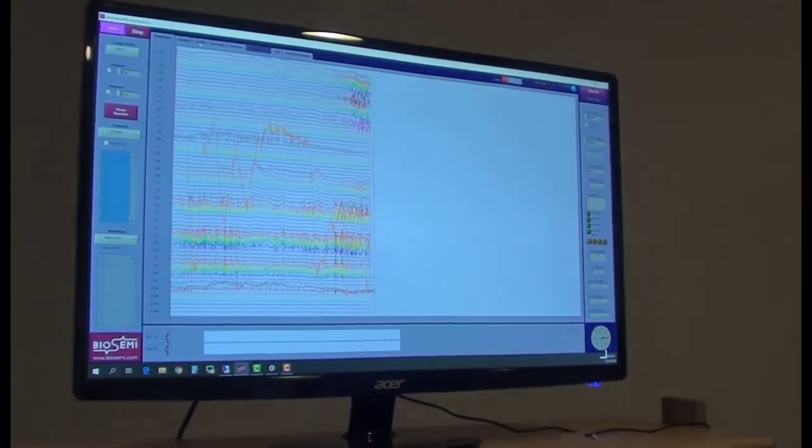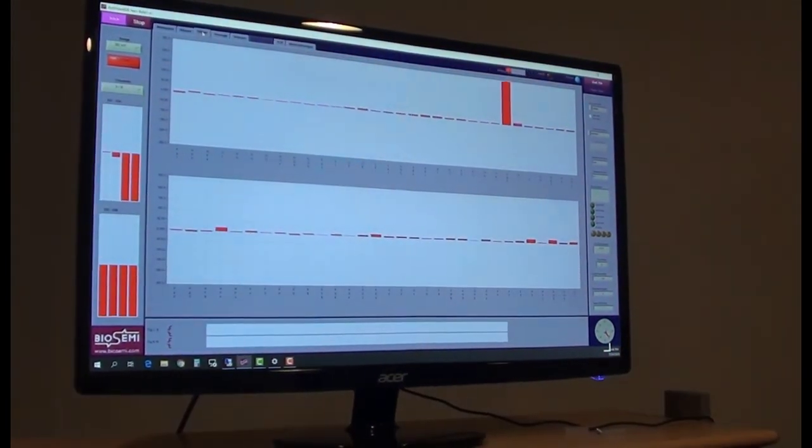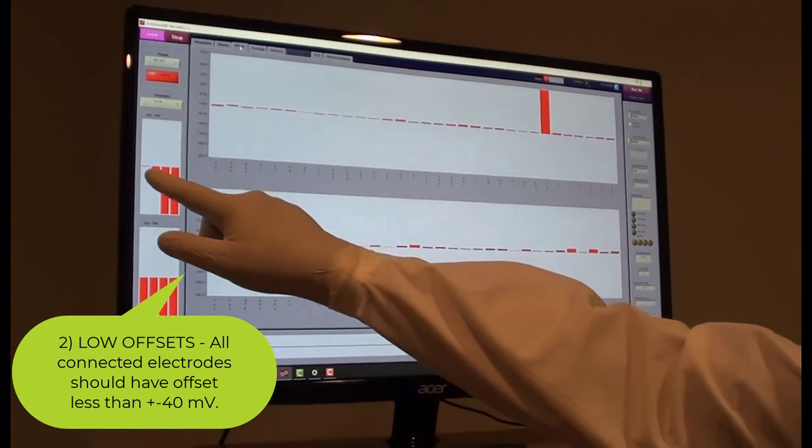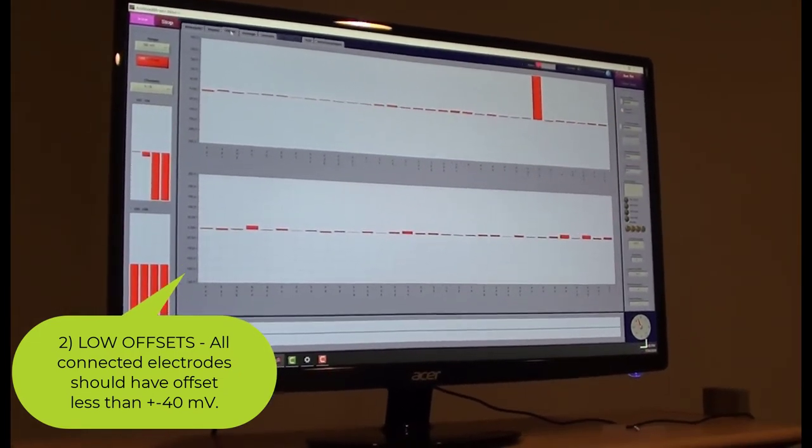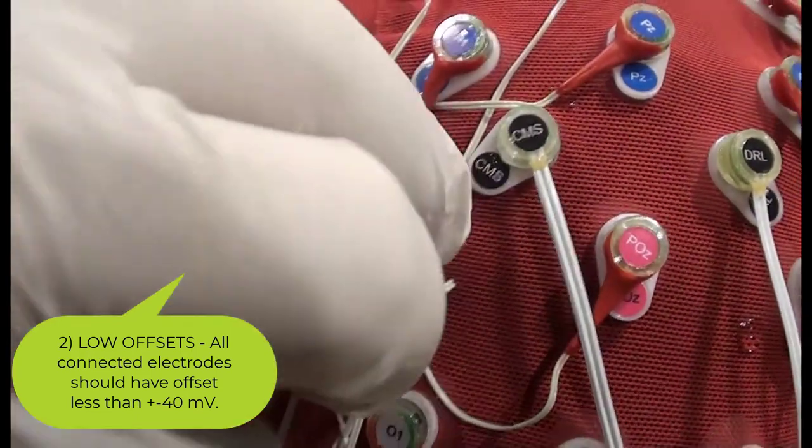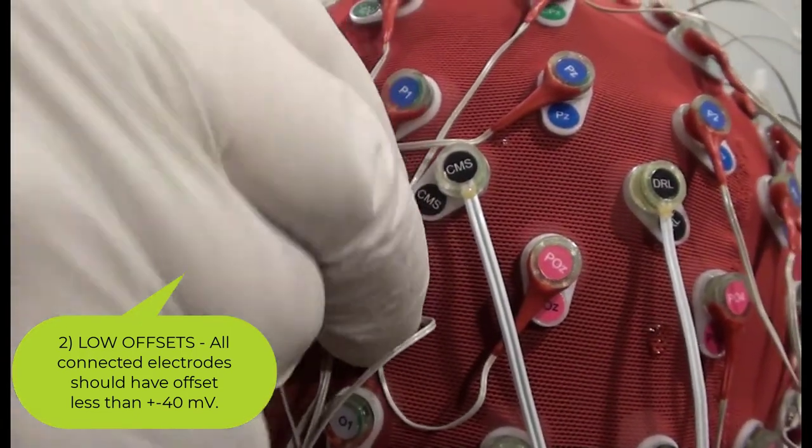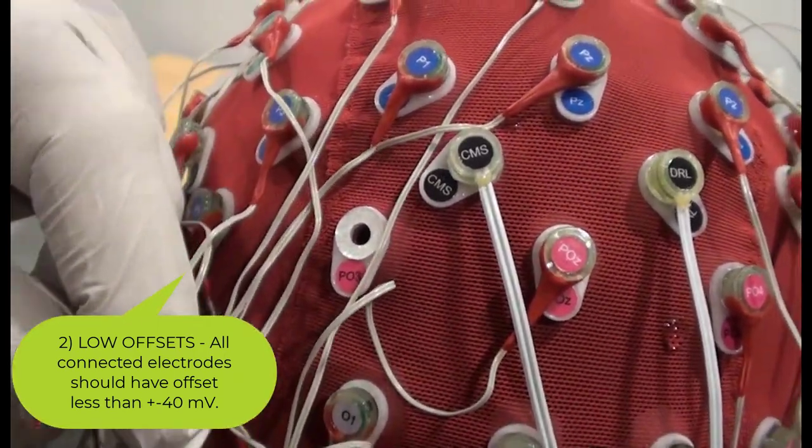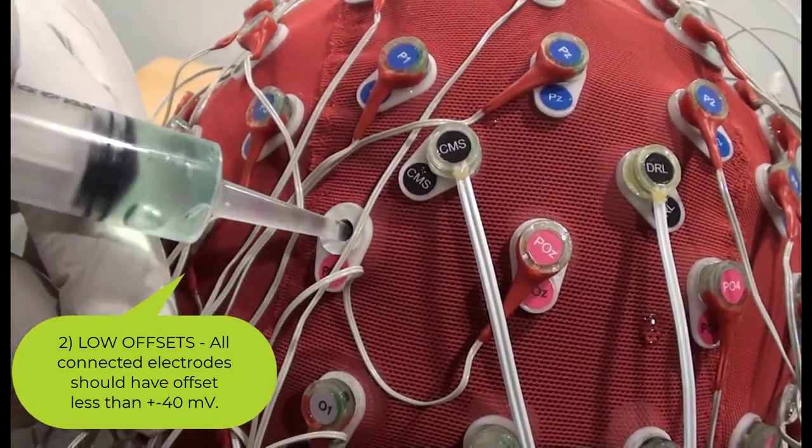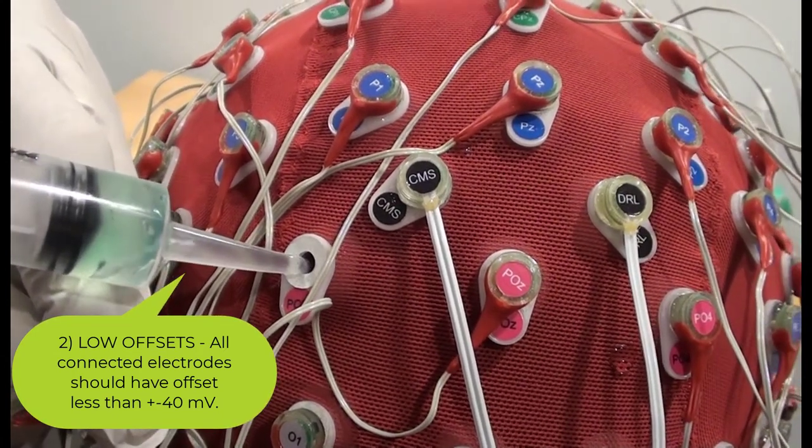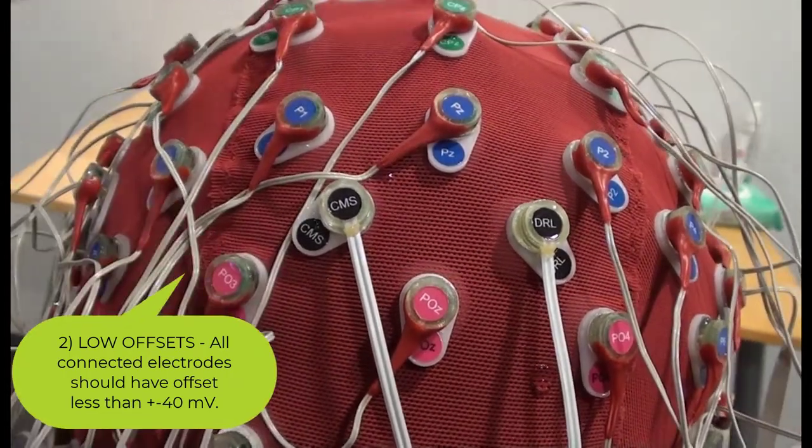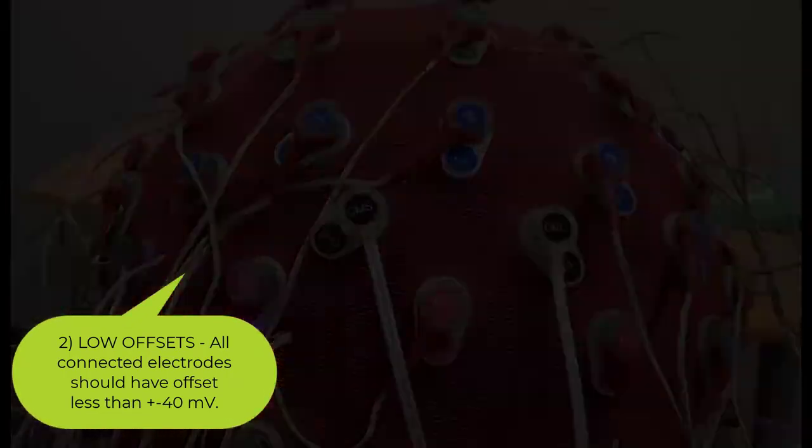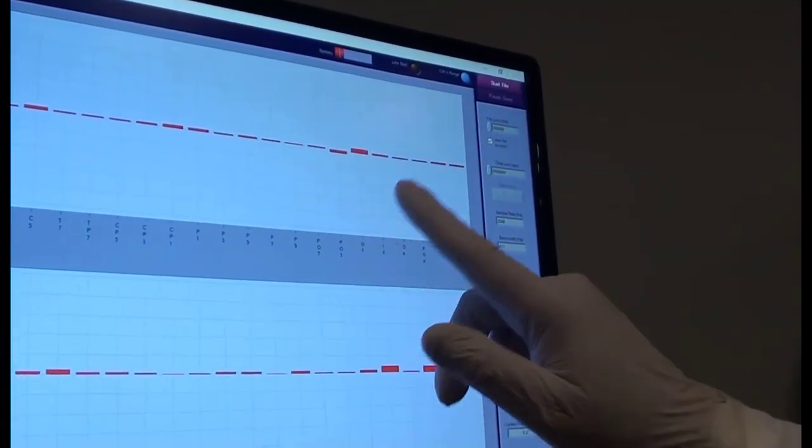With all the electrodes plugged in, you can start the ActiveView software and check the electrode contacts. After opening ActiveView, click Start at the top left to start viewing the incoming signals. Click on Electrode Offsets, the third tab from the left on the top of the screen. On the Electrode Offsets tab, look for electrodes with offset greater than 40 millivolts. Note the channel labels of any out-of-range electrode contacts and go back to the head cap and remove each of these electrodes. Part the hair with the syringe tip and inject more gel. Reinsert the electrodes and check each contact as you go.